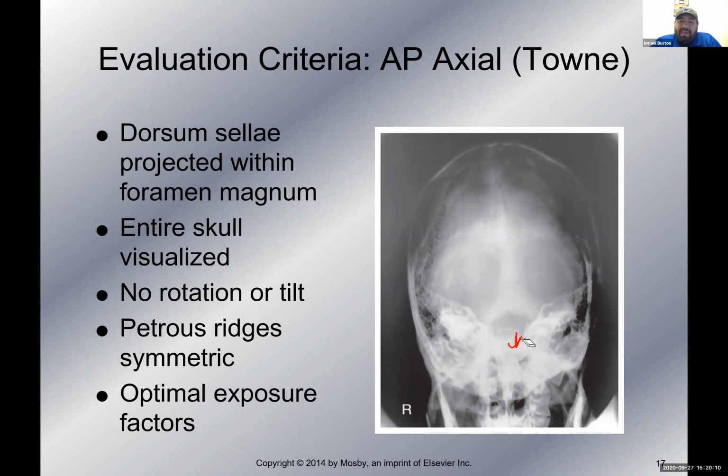So those, again, are things you're going to have to remember, especially for these AP projections of the Towne and then the PA projections. You're going to have to remember, well, if something happens, why did that happen?